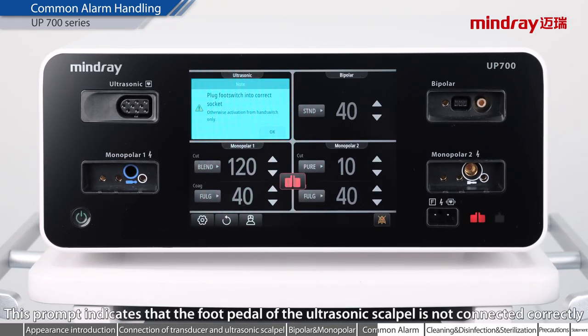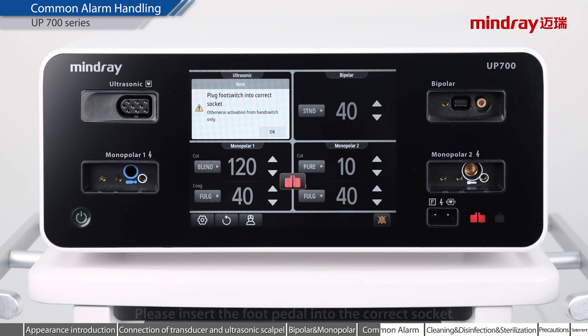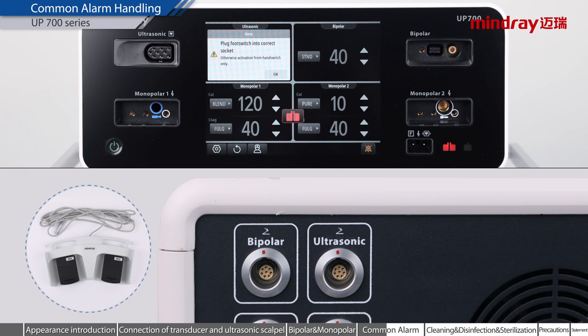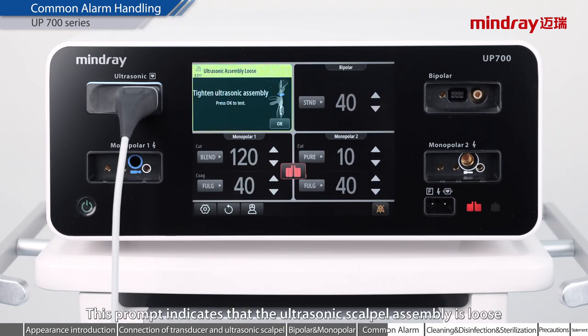This prompt indicates that the foot pedal of the ultrasonic scalpel is not connected correctly. Please insert the foot pedal into the correct socket. Please insert the ultrasonic scalpel foot pedal connector into the ultrasonic scalpel foot pedal socket. This prompt indicates that the ultrasonic scalpel assembly is loose; please check and tighten the ultrasonic scalpel assembly.